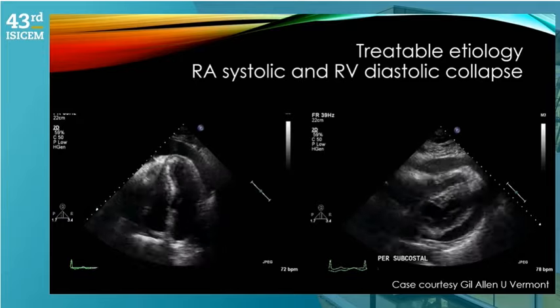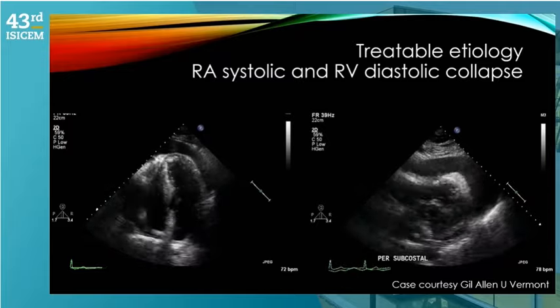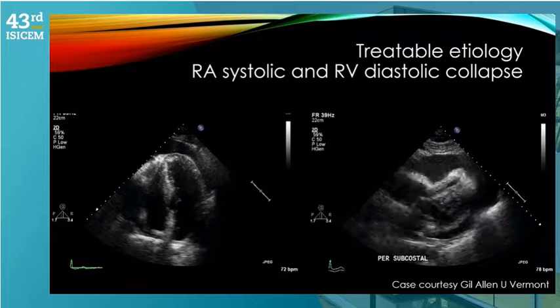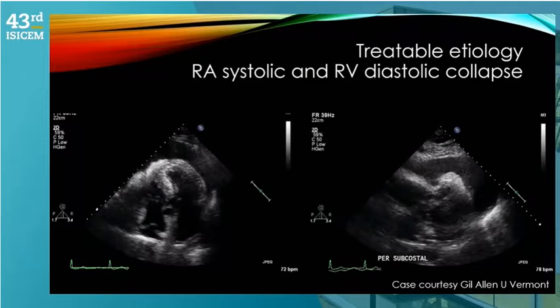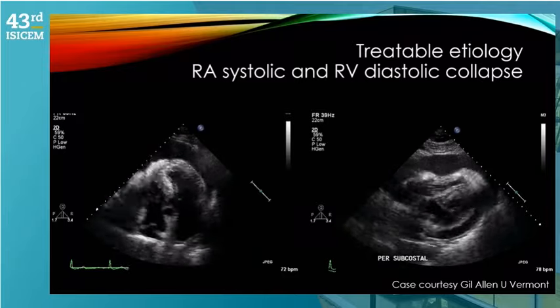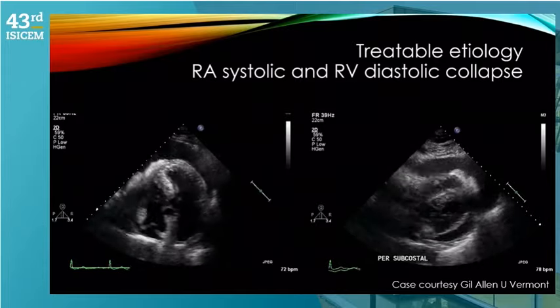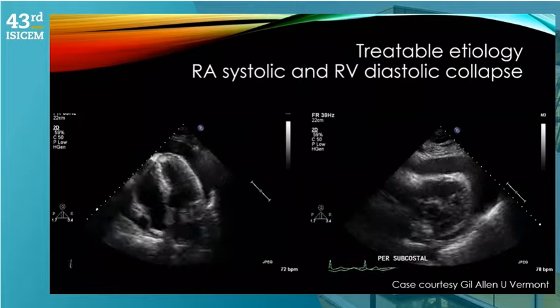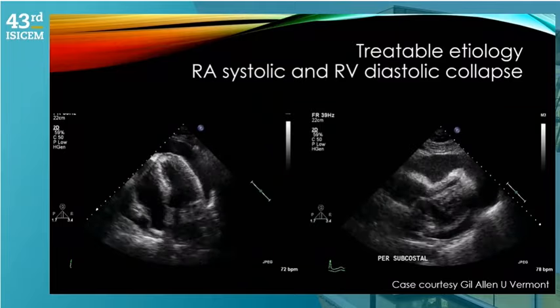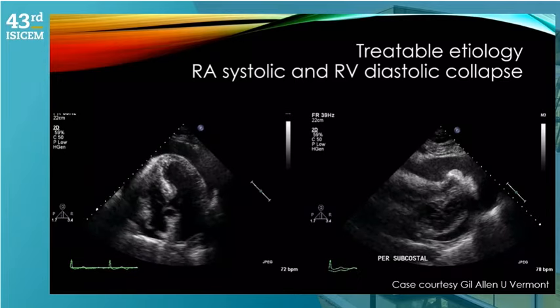Other treatable etiologies include tamponade — these are cases where you can code until the cows come home, but until you relieve the cause of cardiac arrest you don't have a fair chance of helping the patient. On the left you can see an apical four-chamber view with right atrium collapse during systole. On the right, the subcostal view shows a heart struggling to maintain any end-diastolic volume, with RV diastolic collapse. This patient had about 800 ml of pericardial effusion that was emergently drained, stabilizing hemodynamics before surgery to find the underlying cause.